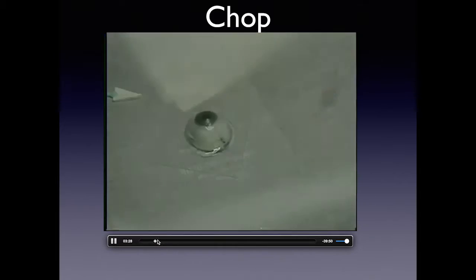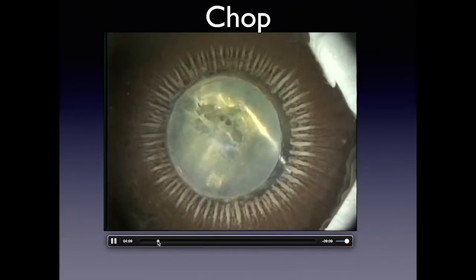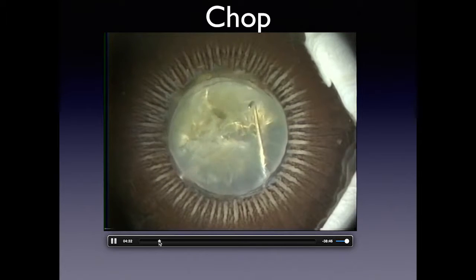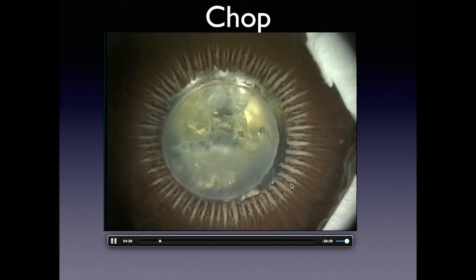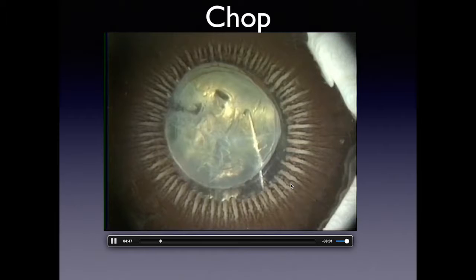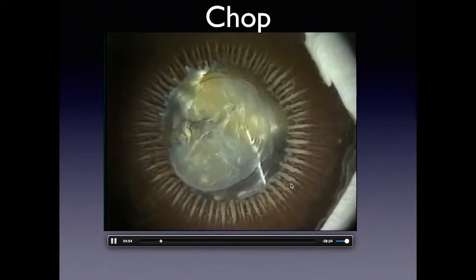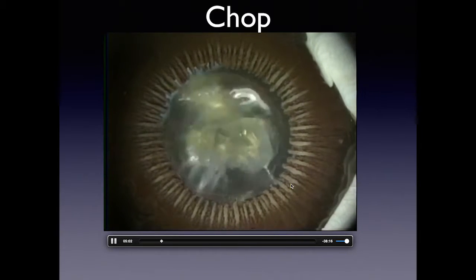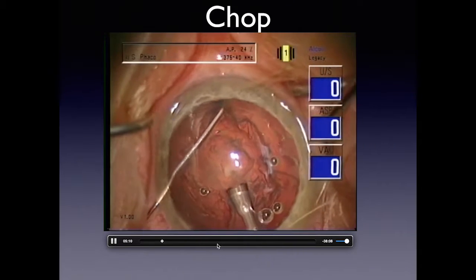We made a video using what's known as a Miyake view — looking from the vitreous side — where you can see the zonules and ciliary processes. This allows us to analyze different techniques to determine which are safe and how they work. We use this approach on CTRs, different implants, and here on a chop technique to understand the modality so you don't break through. Here we'll do a horizontal chop: the handpiece goes out, we're not occluded, we go into the nuclear chip and bury it, then the chopper is brought to the tip.